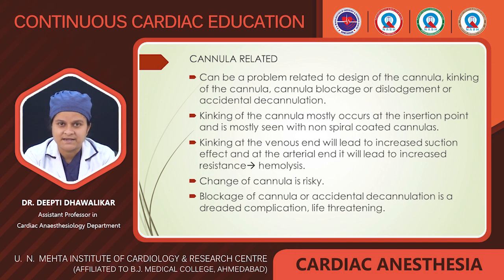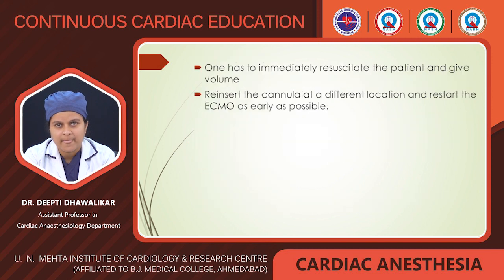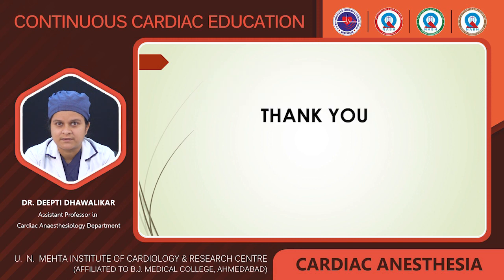Change of cannula is risky because it can give rise to precipitous bleeding and hemodynamic instability. Blockage of cannula or accidental decannulation is a dreaded complication. It can be even life-threatening at times. One has to immediately resuscitate the patient and give volume and reinsert the cannula at a different location to restart ECMO as early as possible.